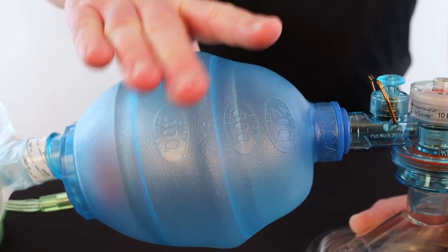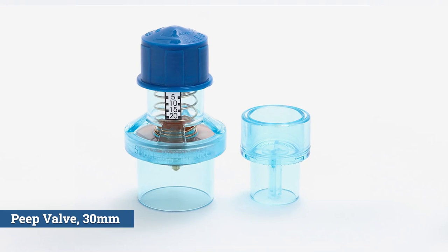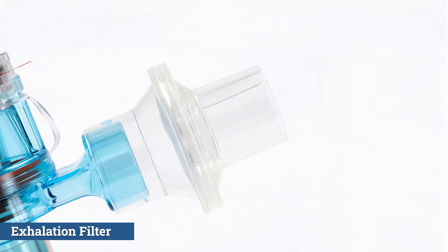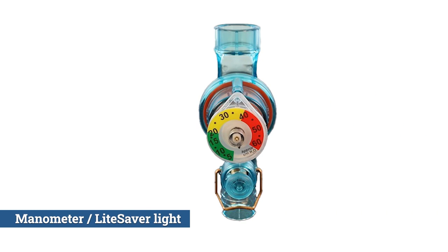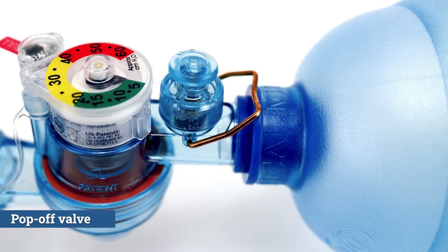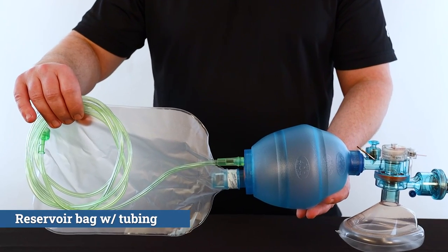Guaranteed to meet your agency's needs, the CPR2 Plus offers configurations to include additions of PEEP, viral bacterial filter, manometer with or without a LiteSaver timing light, pop-off valve, and reservoir bag with tube.